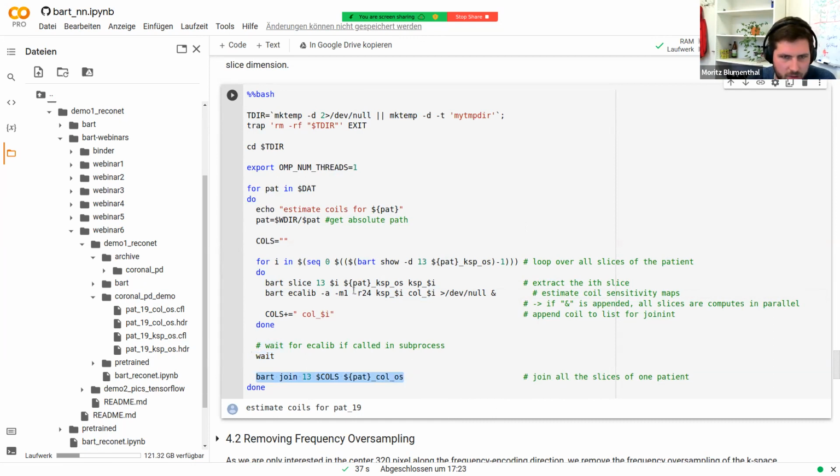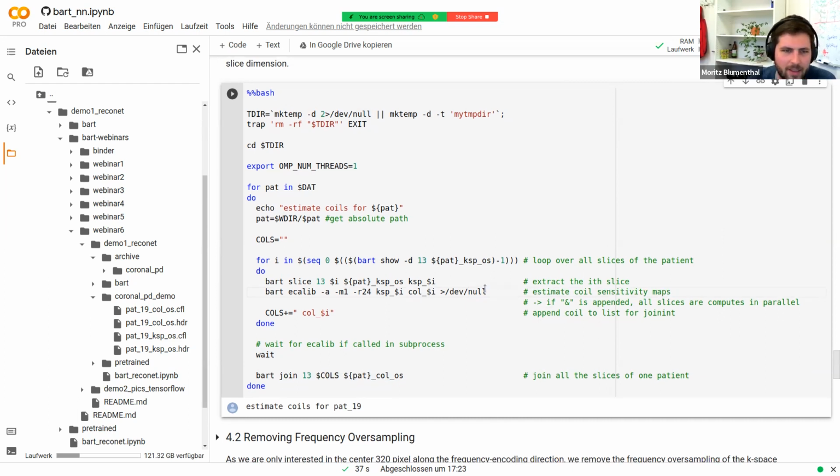Yes, I would use it. For me, it was usually faster if I have multiple cores available. But you can also run that on a GPU. Mm-hmm. And here we just have one CPU core, but a GPU, so the GPU is faster and we do it sequentially.